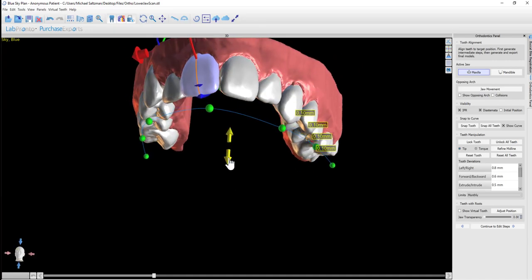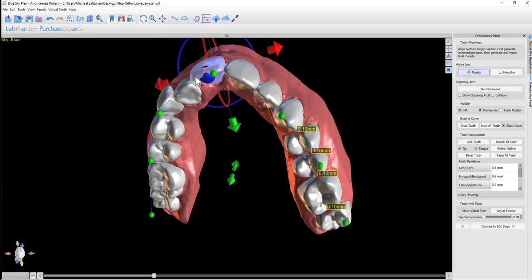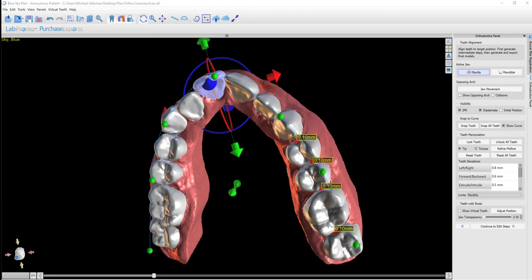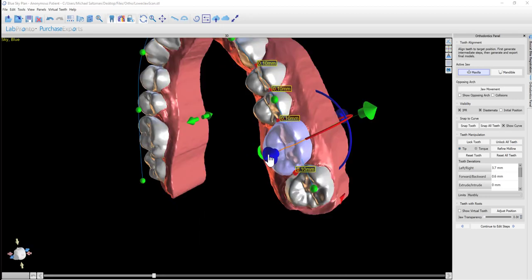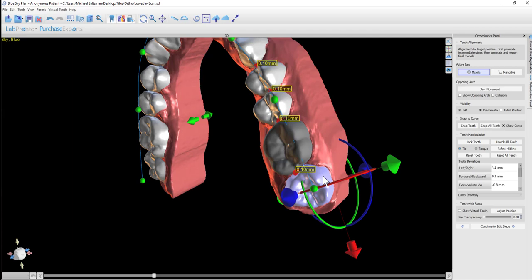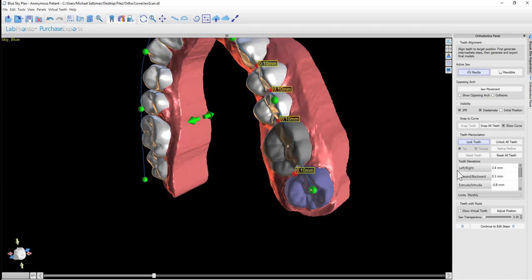We have the curve. The curve can be moved up and down. You can change the curvature of the curve if you like, then click snap all teeth and the software will update that. If there's a particular tooth or several teeth that you don't want updated from the snap to curve, you can click on the tooth to make it active with the widget and then just click lock tooth. So any time you use snap to curve, the locked teeth will not move and will not snap. If you want to unlock all teeth, simply click unlock all teeth.